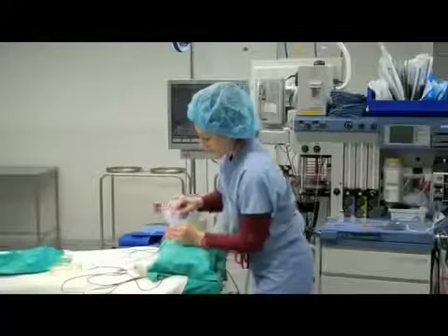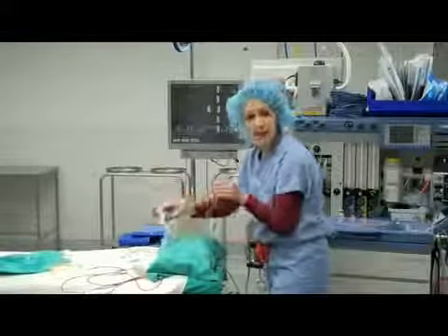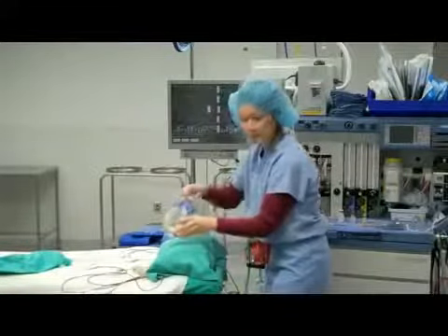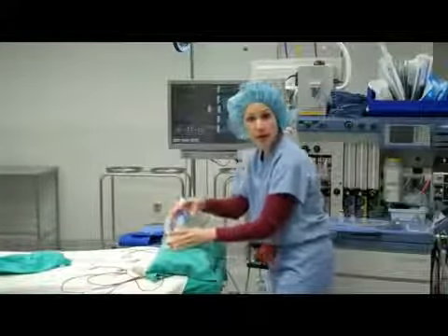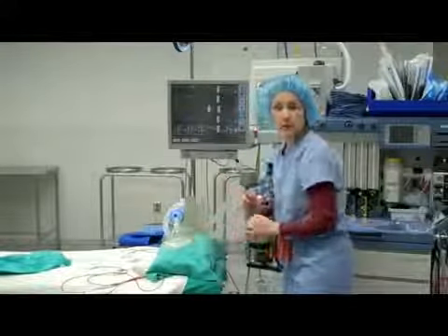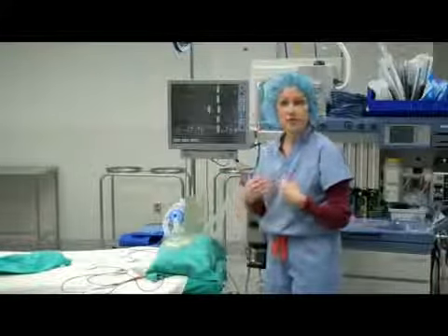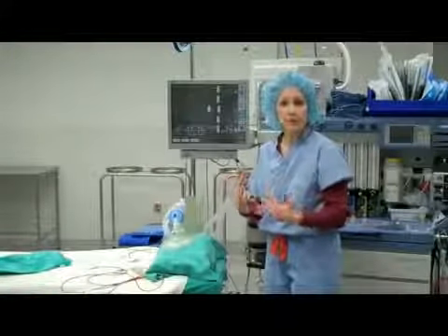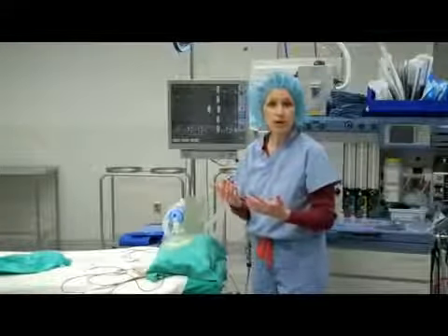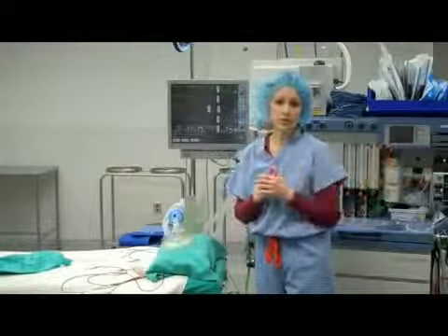So here's our breathing tube that was attached to the circuit. We then go ahead and gently take the breathing tube out. We put the mask back on the patient's nose and mouth, and then have them just breathe in the oxygen through the mask. At this point, we're continuing to assess our patients, making sure that they're comfortable. If they're not, we can go ahead and give them additional pain medications. And then we transport them to the recovery room.